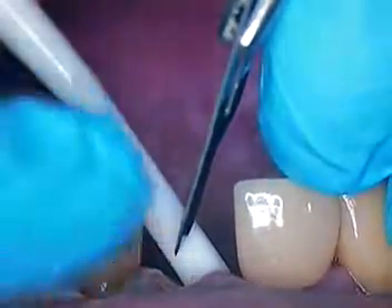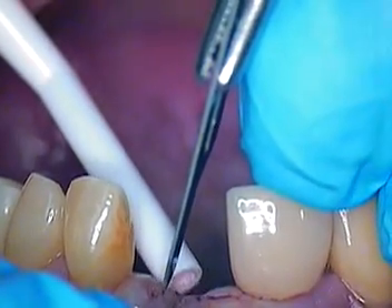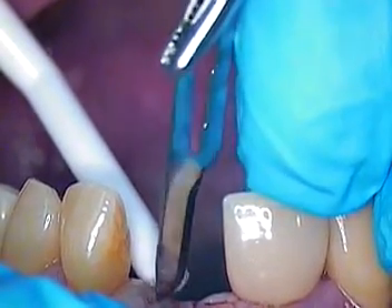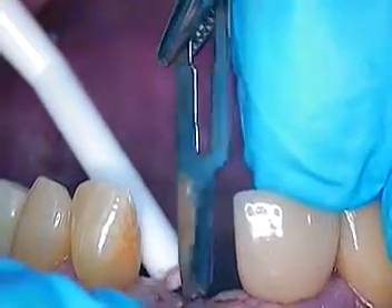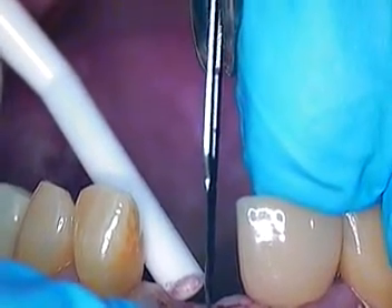I'm just basically going to take a little bit of the tissue away, nothing from the facial aspect. We want to maintain the facial aspect and come around to the palatal. I'm just gently going in. Let's make a primary incision. You okay? Good.